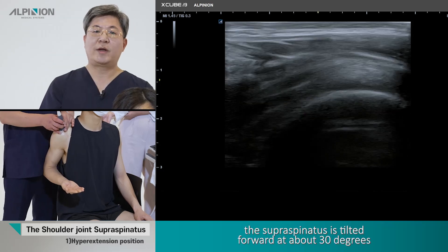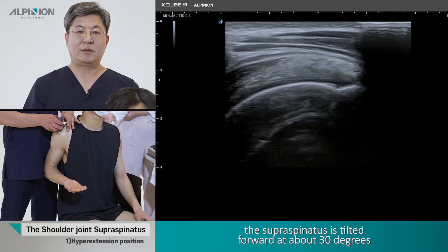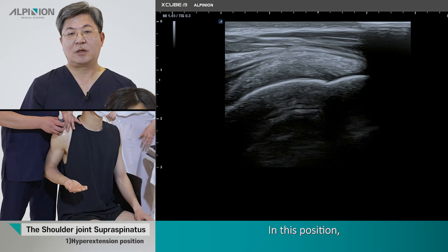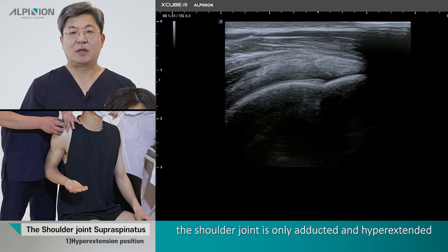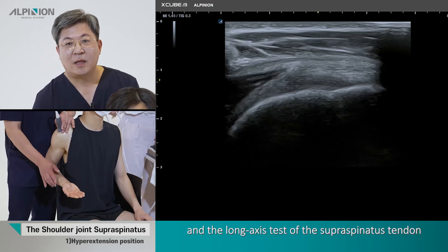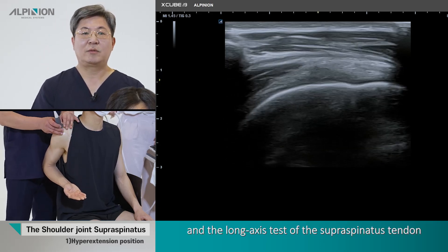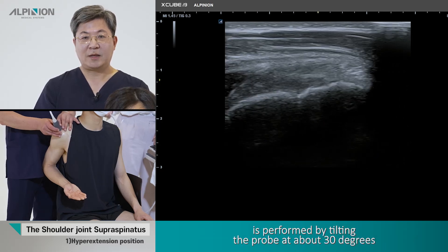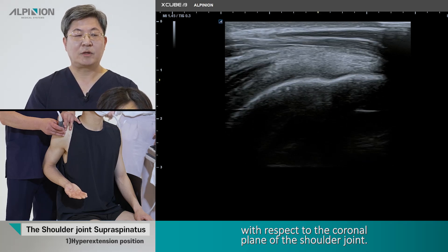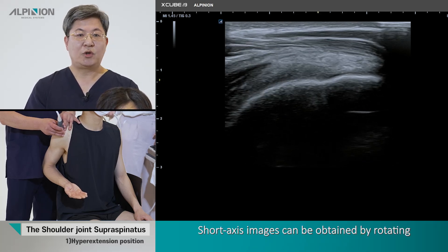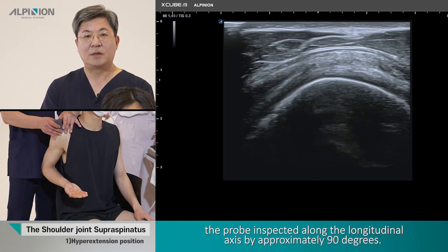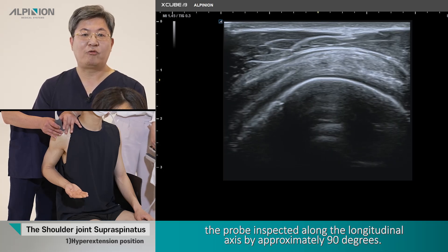Normally, the supraspinous tendon is tilted forward at about 30 degrees with respect to the transverse section of the thorax. In this position, the shoulder joint is only adducted and hyperextended, but not internally rotated. The long axis view of the supraspinous tendon is obtained by tilting the probe forward at about 30 degrees with respect to the coronal plane of the shoulder joint. A short axis image can be obtained by rotating the probe along the longitudinal axis by approximately 90 degrees.